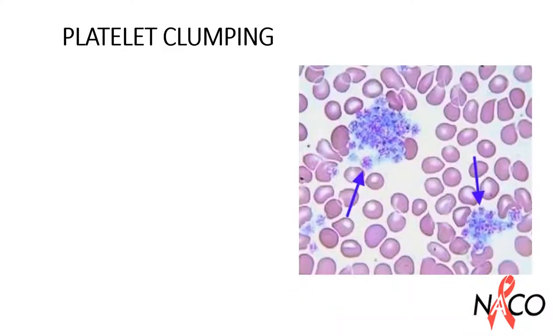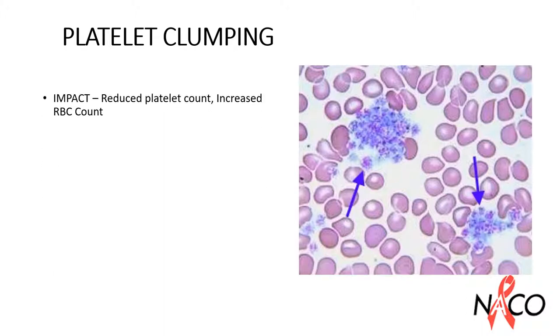Platelet clumping can impact results by causing a reduced platelet count and increased RBC count. The causes of platelet clumping are poor mixing and overfilling of additive tubes.